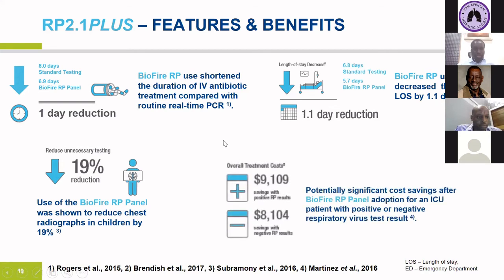And again, despite the fact that it is a PCR-based technology, and it definitely will not be as cheap as other diagnostic tests, as has been highlighted by Dr. Kitchen, it's important to look at it from a holistic perspective also, where in some of the studies they showed significant cost savings for ICU patients, whether positive or negative. And this was mainly linked to obviously length of stay and length of additional tests and treatment. So it may not be the cheapest test on the market, but holistically it has some downstream cost benefits.